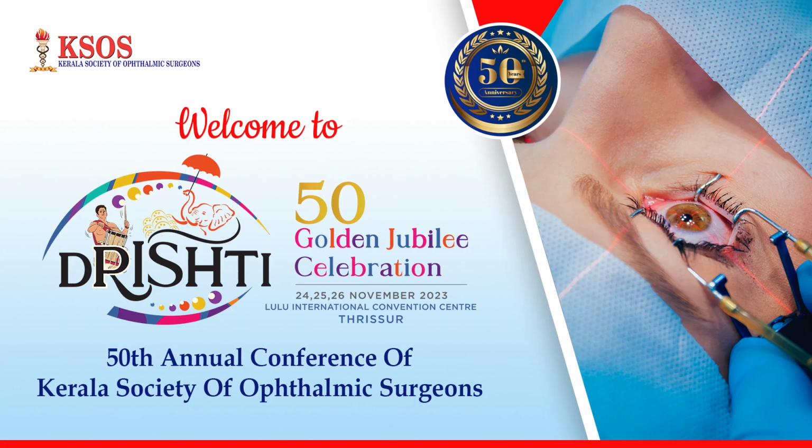So what is the aim of our study? To report the outcomes of pars plana vitrectomy with sutureless intrascleral fixation of a three-piece IOL in the ciliary sulcus in patients with aphakia of various etiology.